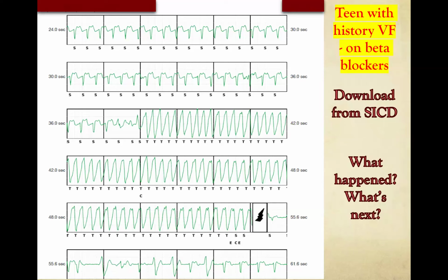But I think in the situation you're describing, that patient had a single ventricle, which was part of the reason why the SICD was used, because obviously placing transvenous leads in single ventricles carries a lot of risks, the most important being thrombosis and stroke and things like that. Although we're becoming a little bit more lax about putting in atrial leads in that patient group, again, still a risk.